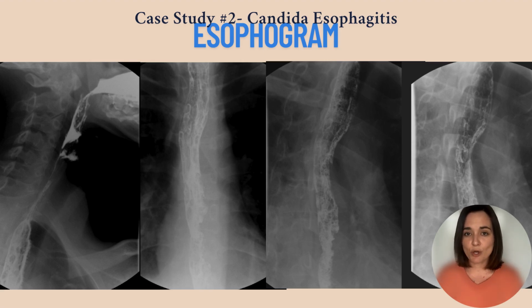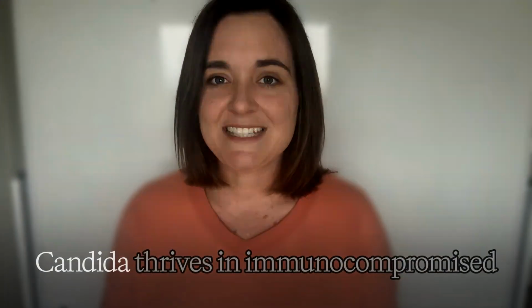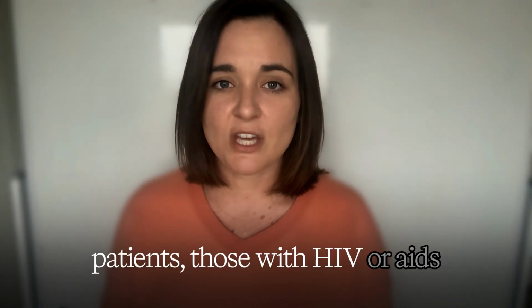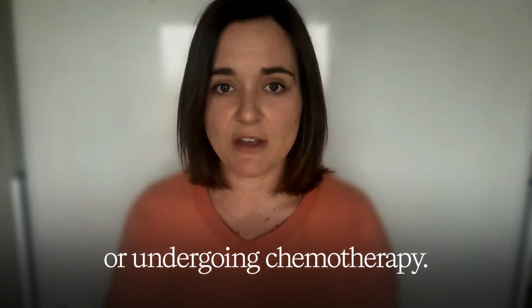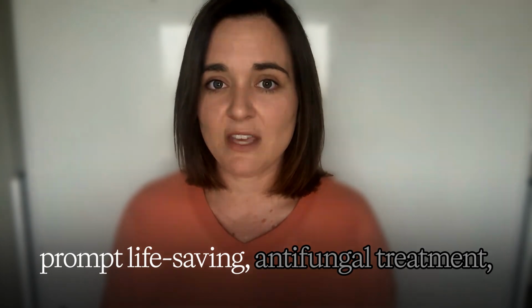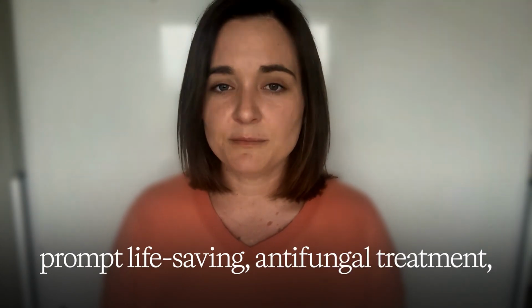RAO enhances the mucosal coating by moving the spine off the midline, allowing these subtle lesions to appear. Lateral and AP views help confirm the length and depth of involvement. Candida thrives in immunocompromised patients, those with HIV or AIDS or undergoing chemotherapy. Recognizing these signs early can prompt life-saving antifungal treatment.